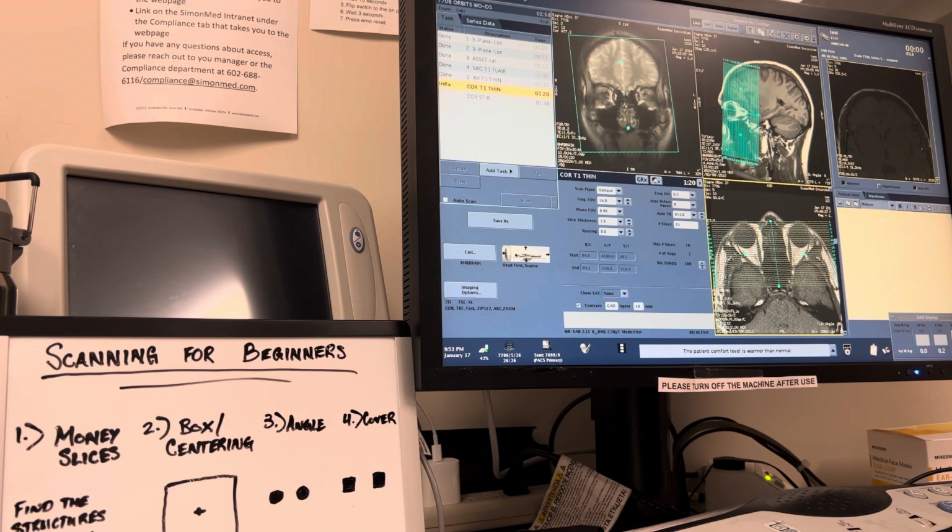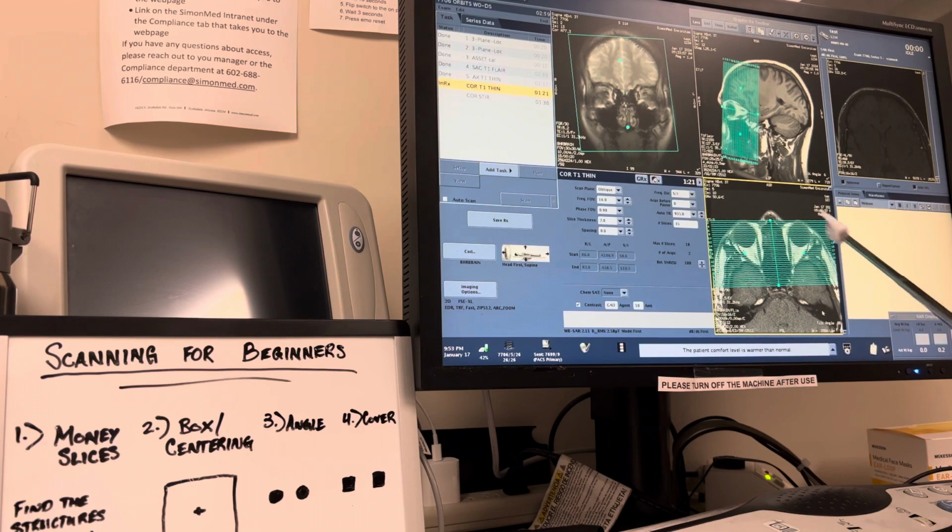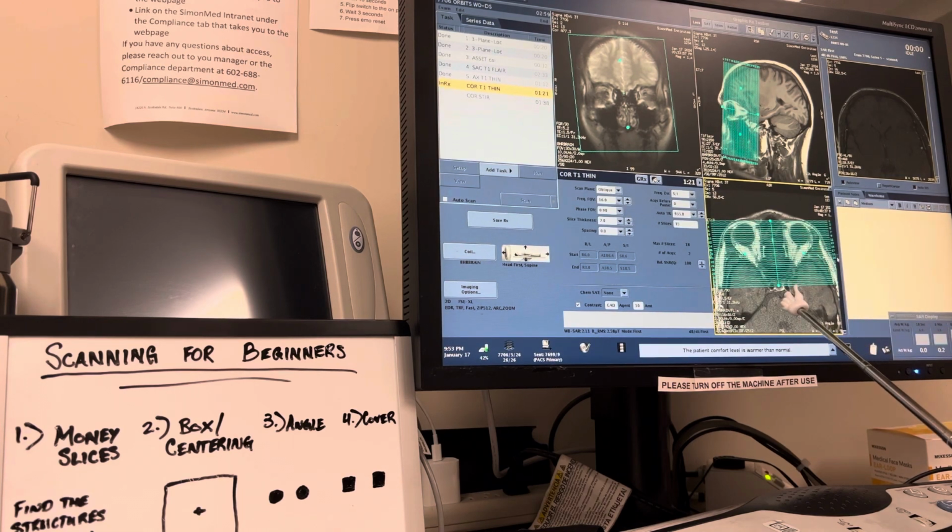There you go. Okay. Now, what we're gonna do is we're gonna find the optic chiasm. So let's scroll back down. Now we're officially on step 4, coverage. Let's scroll down so we could see the optic nerves. You could see them converging right here at the optic chiasm, that X looking structure right here. And we like to provide additional coverage. I like to go back to the pons, so let's add like 4 slices. 1 more. 5, yeah, sorry about that. Okay, so this looks great, so let's save that.